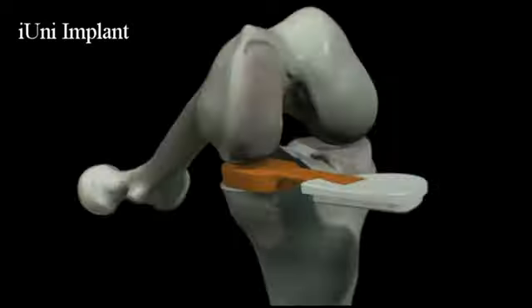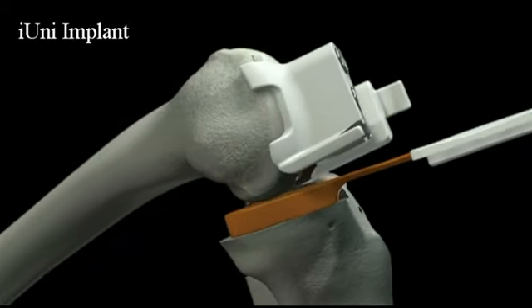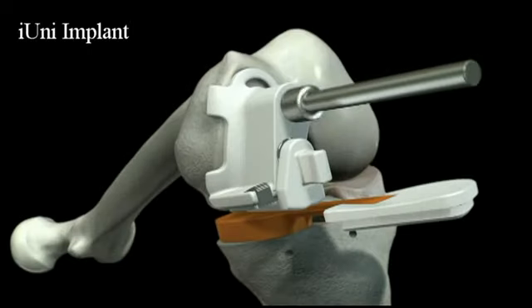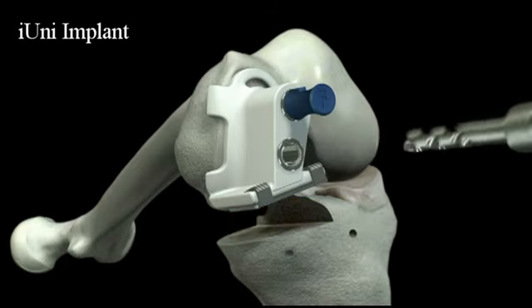Step 4. Femoral preparation. Attach the L-guide to the bottom pinhole on the femoral iJig and place it on the condyle with the knee in approximately 90 degrees of flexion. Drill and pin the femoral iJig beginning with the proximal pin, using the blue disposable femoral pegs marked F. Remove the L-guide and spacer block in order to drill and insert the second pin.